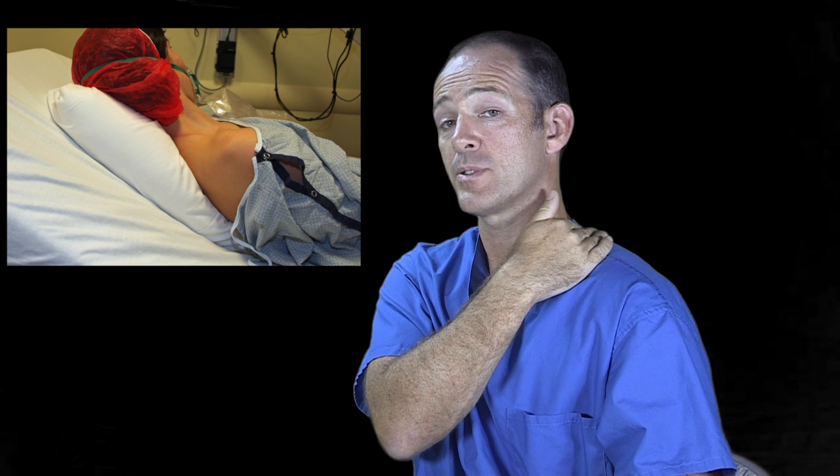Patient position: we position the patient sitting at 45 degrees, head up, with a pillow under their head and shoulders, but we move the pillow across the midline to expose the neck and the operative side. Rotate the head away as well.